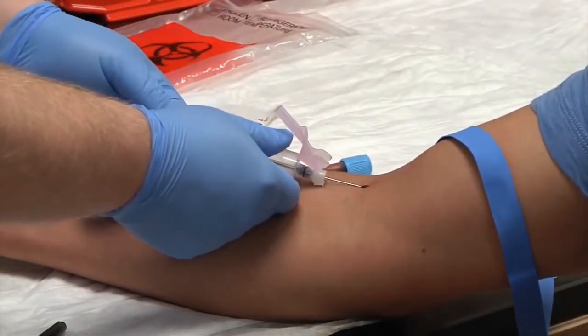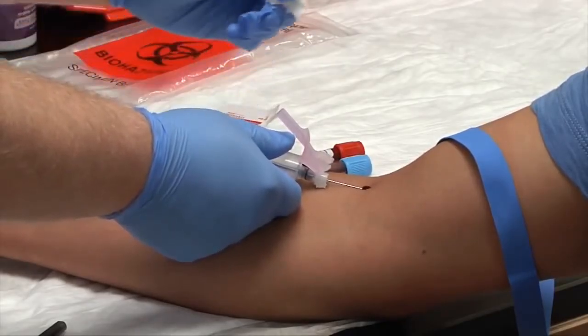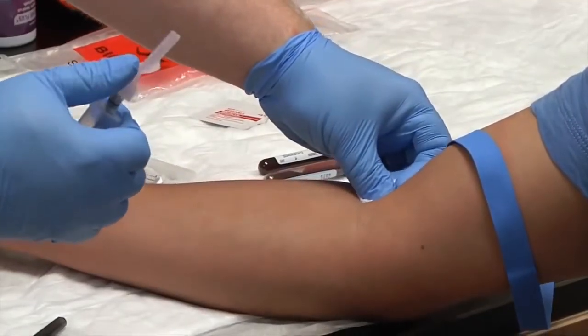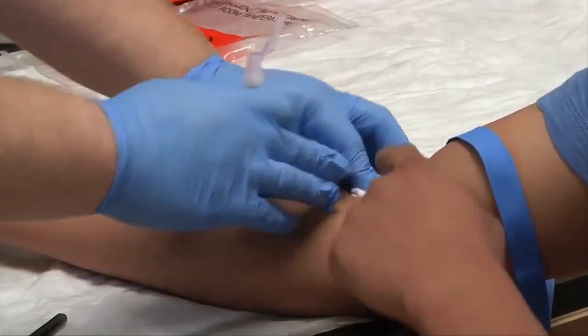Pull the tube out. Get my gauze, fold it over once, twice. Pull my needle out, cover, and immediately safety cap. Ask your patient to hold the gauze. Sir, will you please hold that?